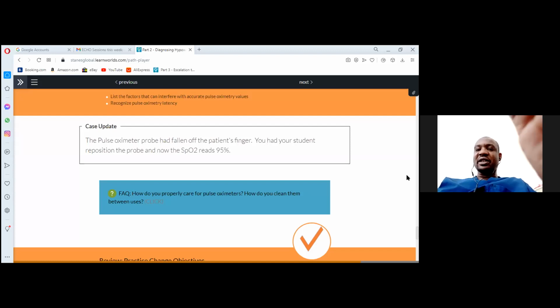It's very important, especially in this era of so many infectious diseases. COVID is there, hepatitis, HIV, so many things. So please, we should try as much as possible to observe these cleaning protocols. It's very important, not just transmitting disease between patients, also between you and the patients.